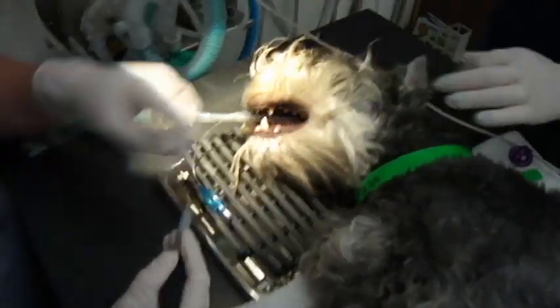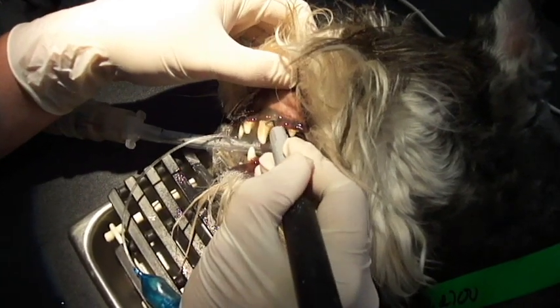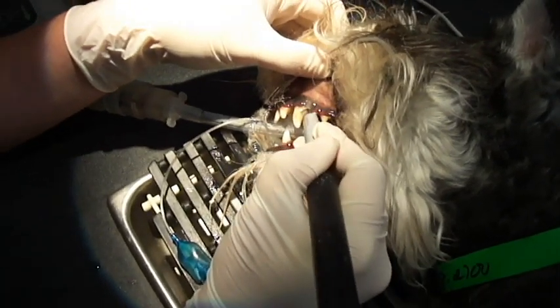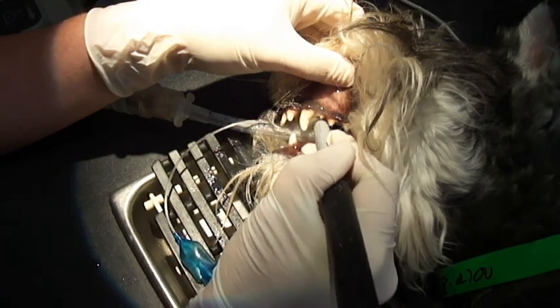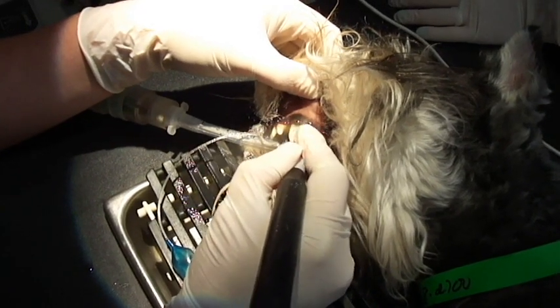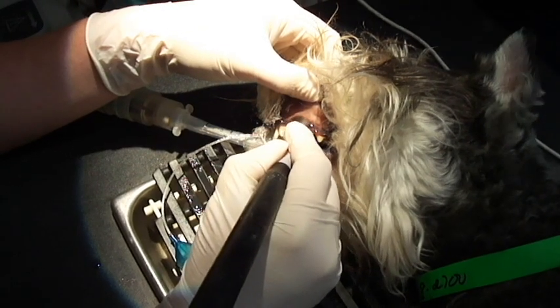Kara, that's great. Keep going. Samantha, what are you doing? I am cleaning the canine tooth right here with this ultrasonic cleaner. Getting all this nasty nastiness off. You're very professional. Thank you.